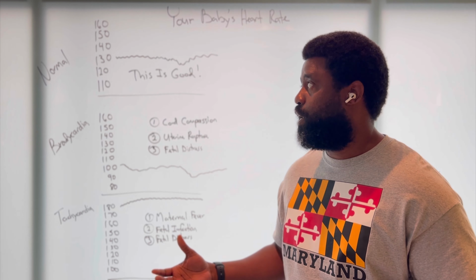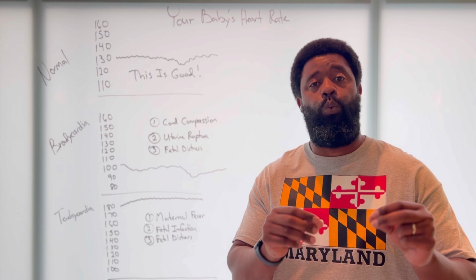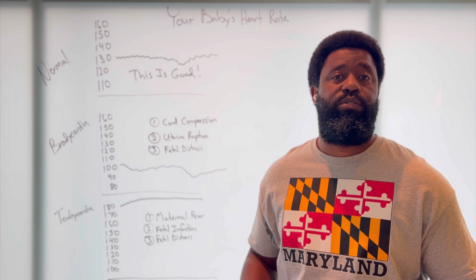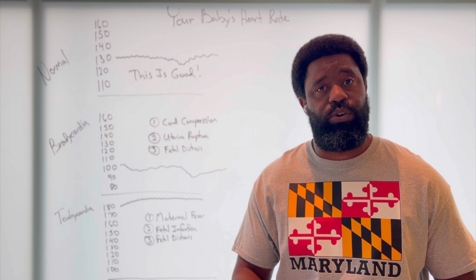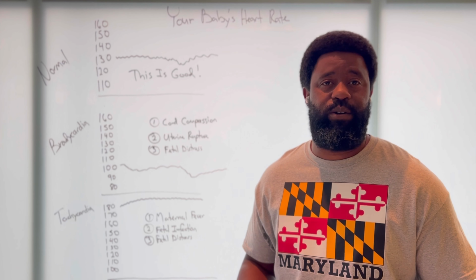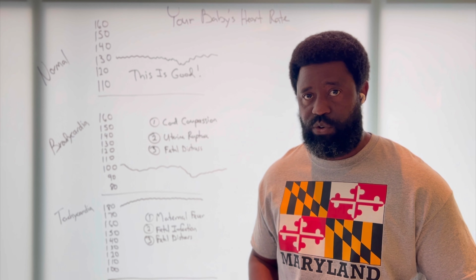Understanding the baby's heart rate during labor and delivery can go a long way when we are trying to help families understand what may have caused their baby's brain injury. Today, I'm going to discuss three of the most common patterns we see when a baby is hooked up to the electronic fetal heart monitor, which helps doctors and nurses understand in real time things like the baby's heart rate, mom's contraction patterns, and whether there are late decelerations, accelerations, or variability. These are all included in the readings from the monitor.